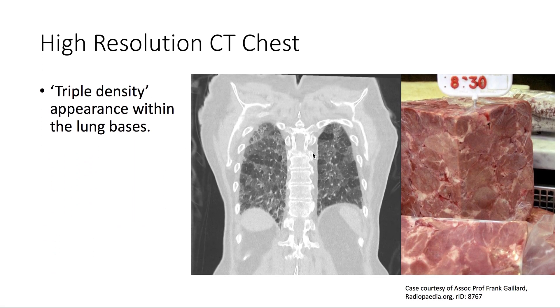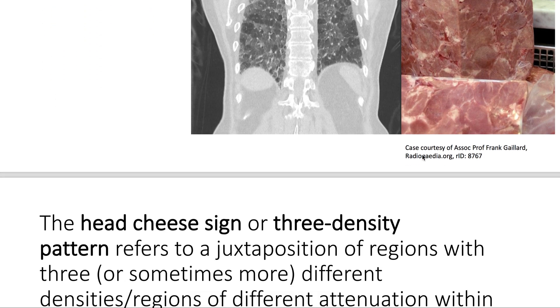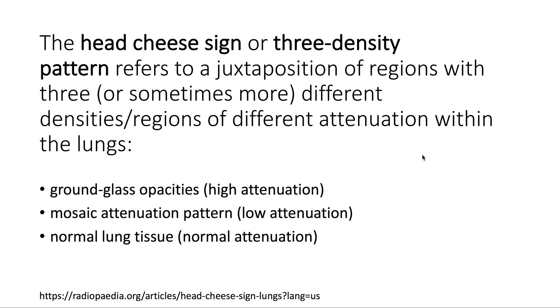Taking a look at the high-resolution CT of the chest, we note this triple-density appearance within the lung bases, or head cheese sign. The head cheese sign, or three-density pattern, refers to a juxtaposition of regions with three, or sometimes more, different densities or different attenuation within the lungs: ground glass, mosaic, and normal lung tissue.